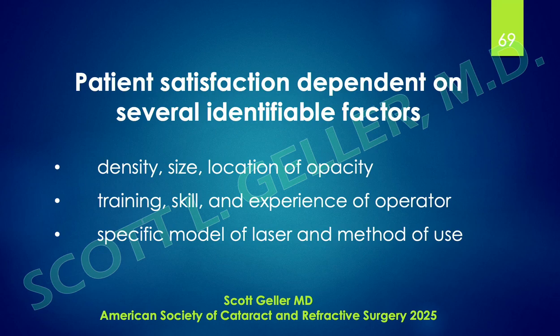So, patient satisfaction. Well, that's dependent on several factors. One is the density, size, and location of the opacity. Obviously, you can have a huge opacity in the periphery, but if it doesn't come in the visual axis, big deal. The other thing is the training, skill, and experience of the operating ophthalmologist.